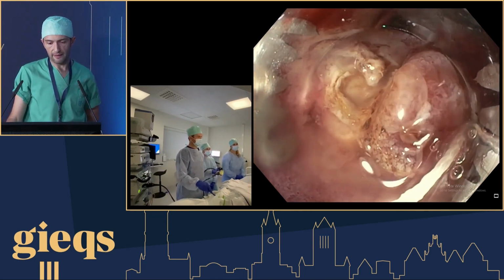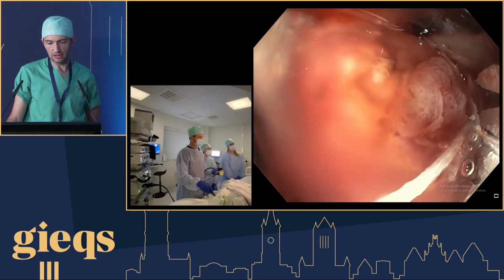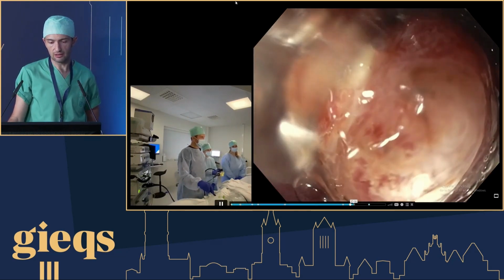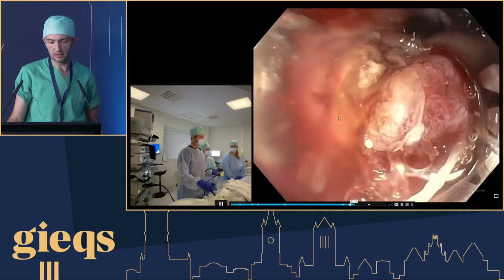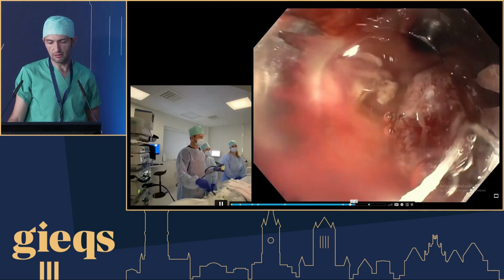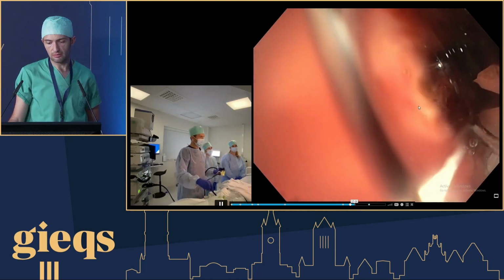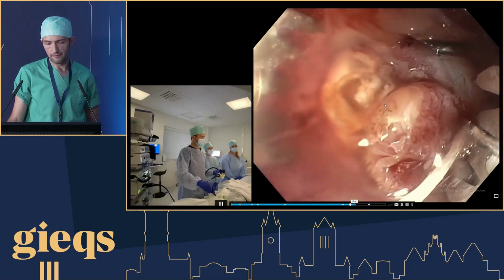And it's simply a case of seeing if it will suction into the cap. I had a cap on the scope before. I think you can see the vessel there, can't you? As it comes up into the device. It's right where the mouse is sitting at the moment, right under here. So you'll see it come up in a second. I mean, you're fortunate the tissue's compliant, David.